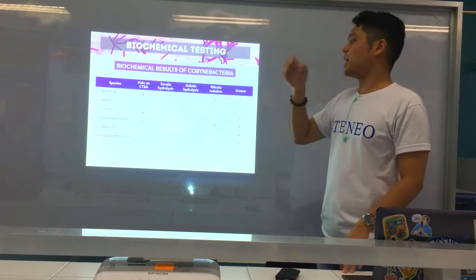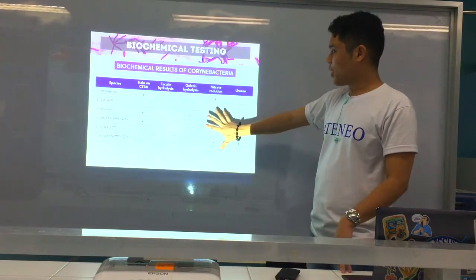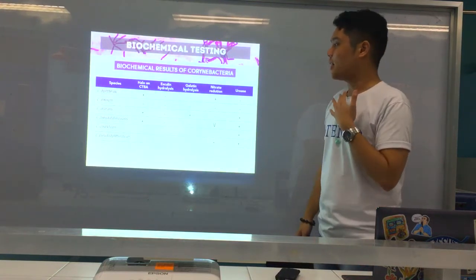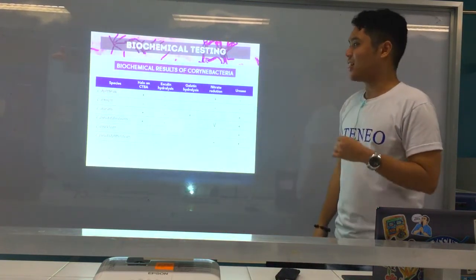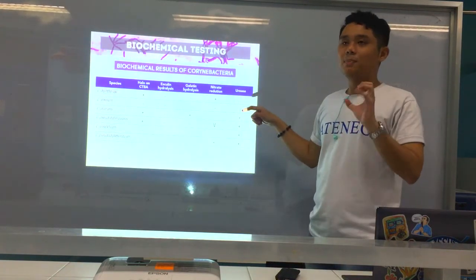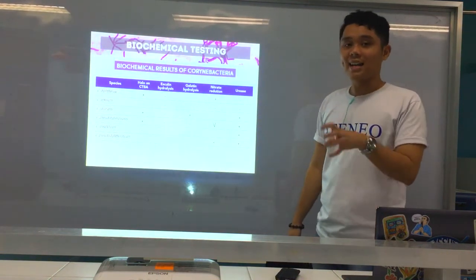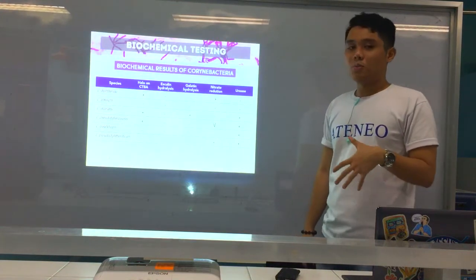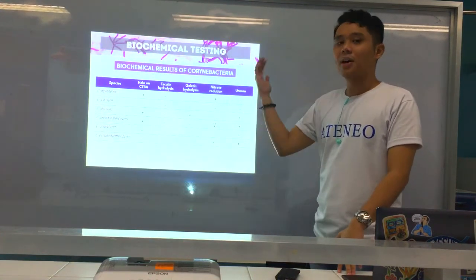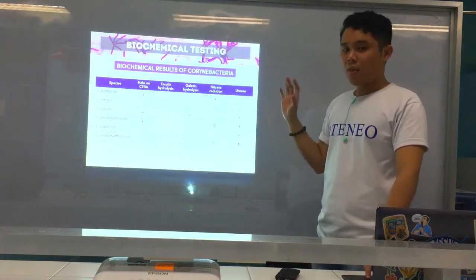Okay, alright. Next, for gelatin hydrolysis, kinsa ang positive? C. ulcerans. And for nitrate reduction, ubay-ubay ang positive, si diphtheriae pa rin and pseudotuberculosis. Okay. Alright. For esculin hydrolysis, negative sila tanan. So again, very characteristic ni C. diphtheriae, it's urease negative. Especially if you want to confirm it or compare it against the other two species na halo on CTBA, si ulcerans and pseudotuberculosis. Again, perform the urease test. Negative si diphtheriae, positive si ulcerans and pseudotuberculosis. Alright. So that's for the Corynebacteria.